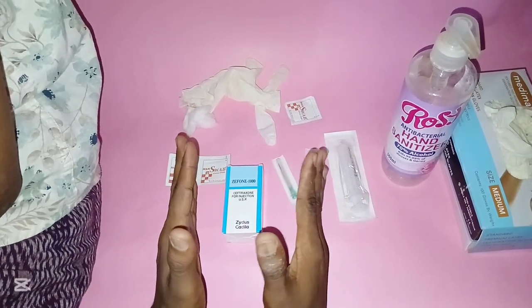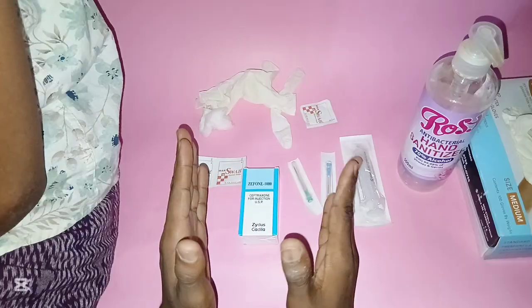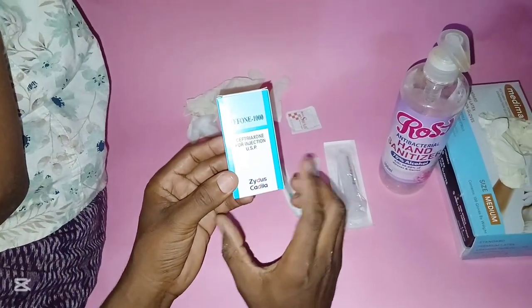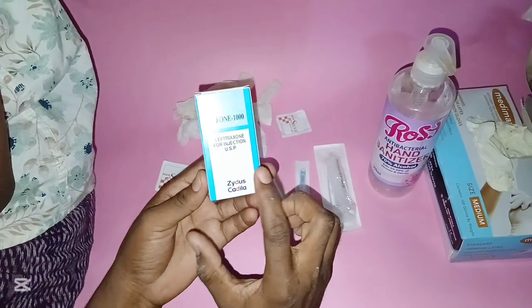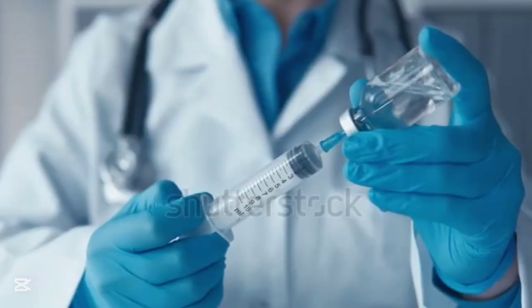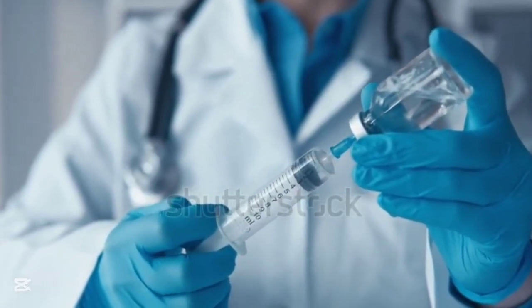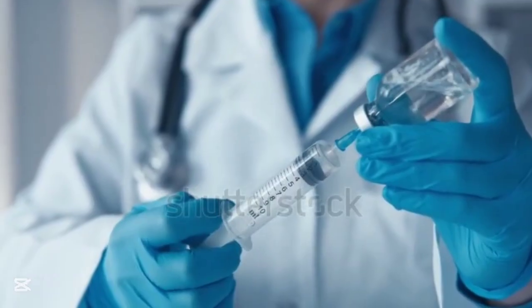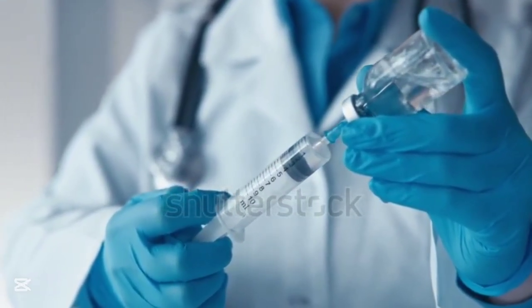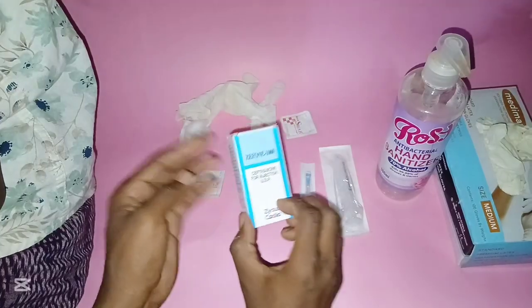Hi there, welcome back. In today's tutorial I just want to show you how you can administer IV ceftriaxone — this is IV ceftriaxone one gram. I just want to show you how you can simply reconstruct or dilute IV or IM ceftriaxone so that you can administer it safely to the patient.